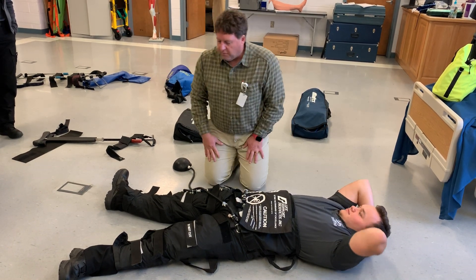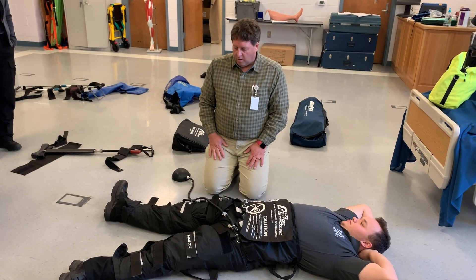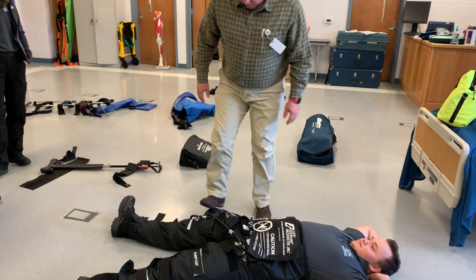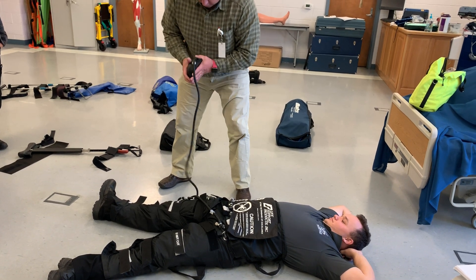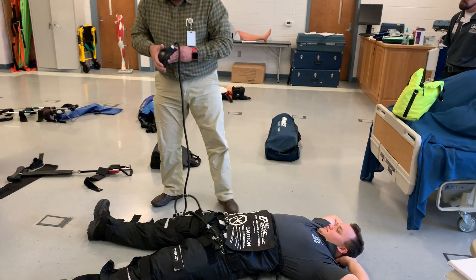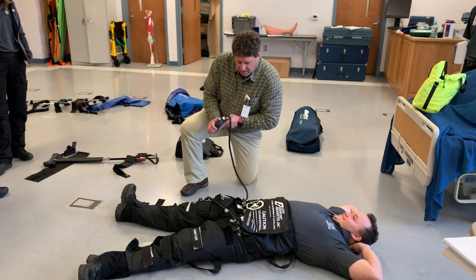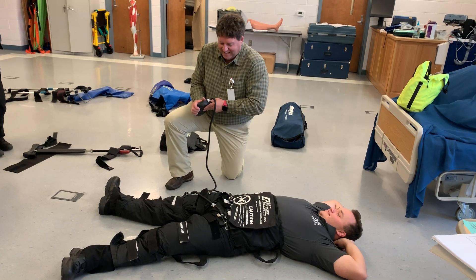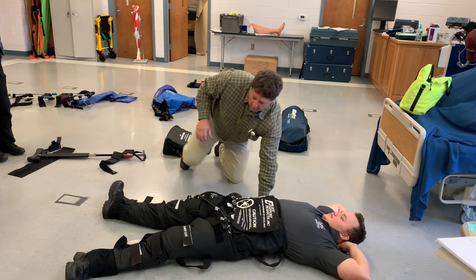I'm going to close off the belly because I don't want to inflate it right now. If just one leg were broken, I'd close the other leg's valve. If I'm doing it for shock, we'll often start with just one leg, but you could do both at the same time. I begin pumping the open leg. The idea is you inflate it until there's enough pressure, then turn that valve off.